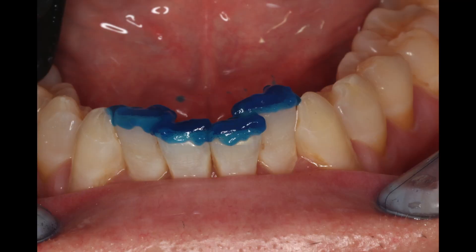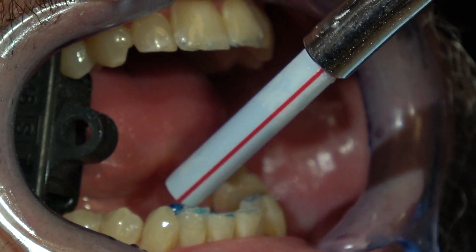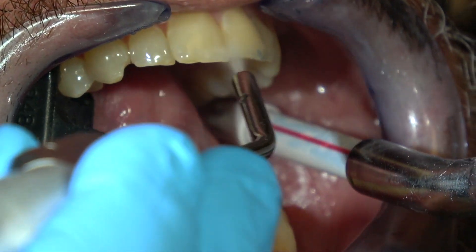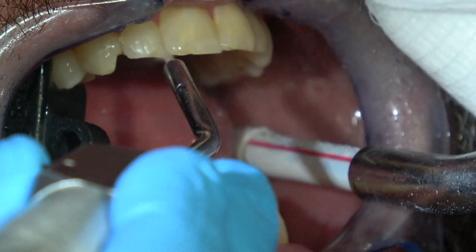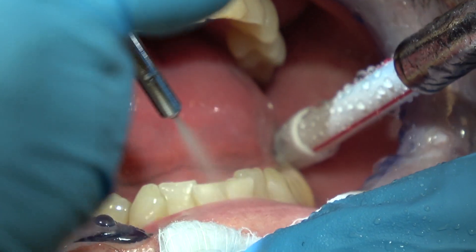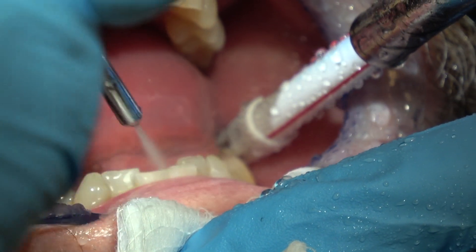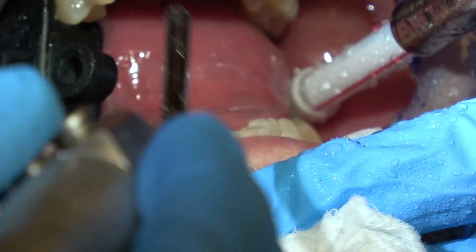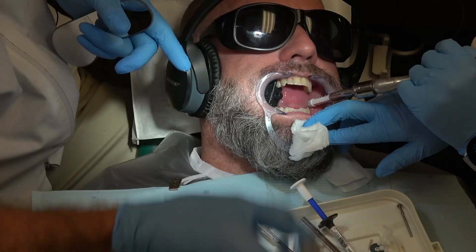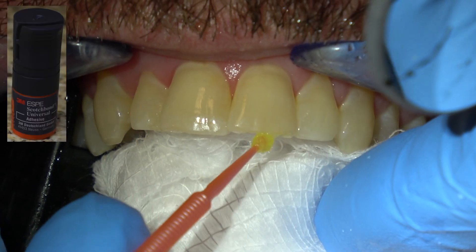That's about 15 seconds. Section this off first with your aspirator, then have the patient turn their head to one side, usually toward the assistant. Most of the time I use a rubber dam for almost everything, but I usually don't use it for this — I just isolate the teeth with two-by-twos because it's difficult. And if you haven't anesthetized the teeth, it can be uncomfortable placing a rubber dam if it pinches the gingival tissue. So I'm just going to dab those teeth — I don't want to desiccate them.